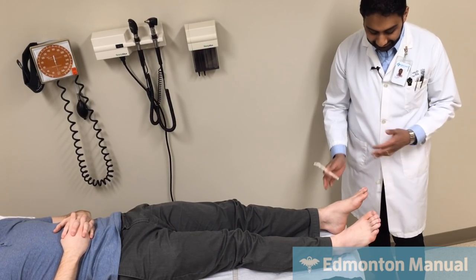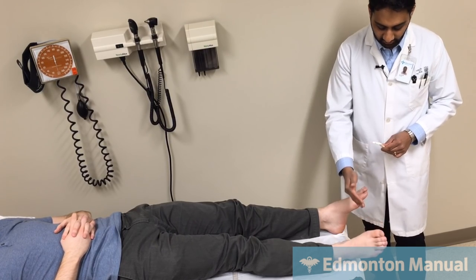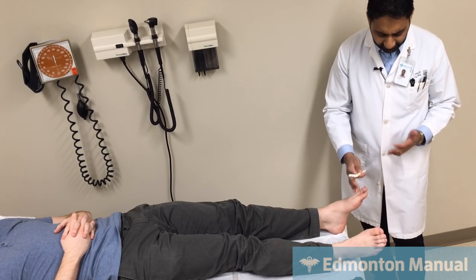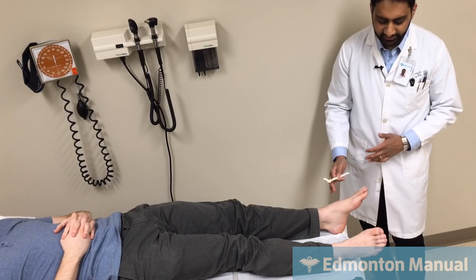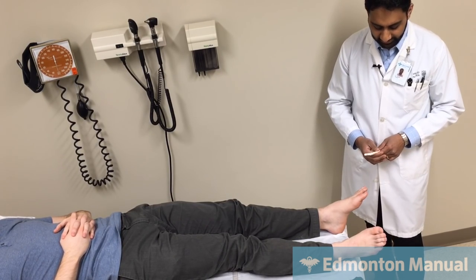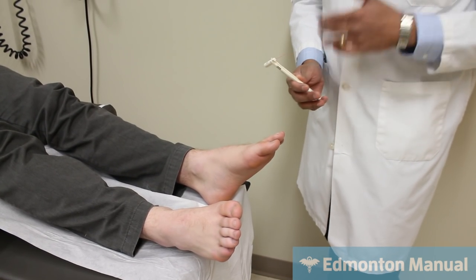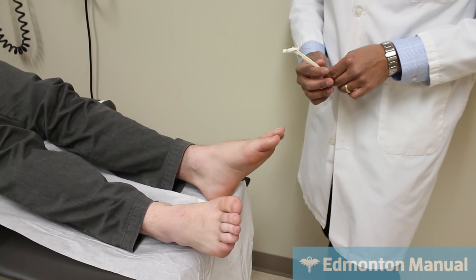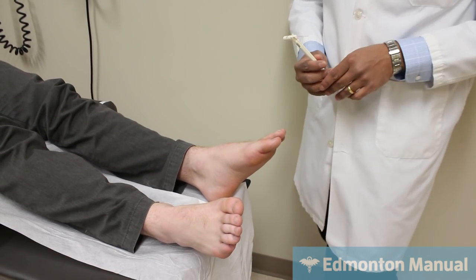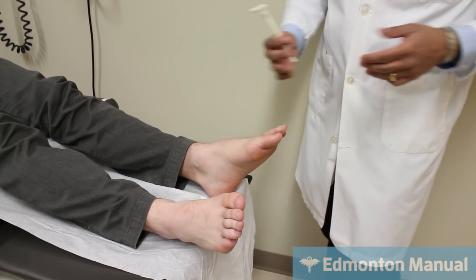If the score is less than 5, and you actually give a half point if they can feel it but it's reduced, but if it's less than 5, I believe it's 3.5 to 5, that starts to increase the concern. That's going to predict some problems with the diabetic feet soon. And if it's less than, I believe, 3, that's a really concerning score, and that suggests poor prognosis in terms of possible ulceration or other abnormalities imminently.